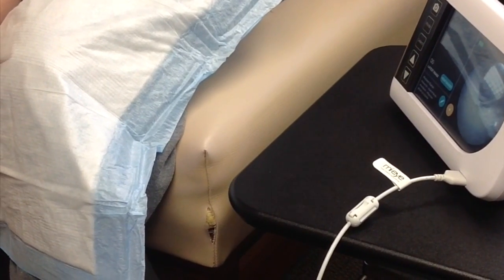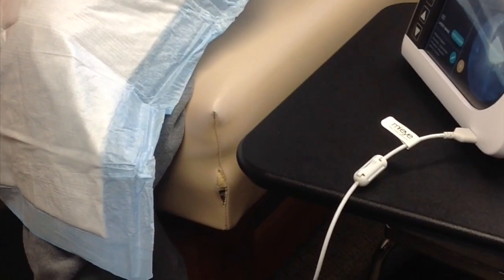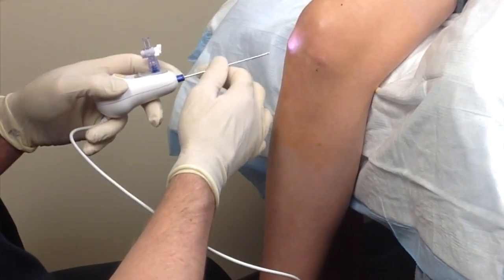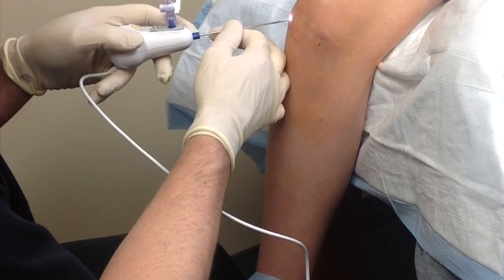Hi, I'm Dr. Chris Doherty. I'm a fellowship-trained sports medicine and orthopedic surgeon at the Agility Center in Bentonville, Arkansas. In this video, we're showing the Trice Medical MyEye device. This is a needle arthroscopy, which allows me to inspect the interior of a patient's joints in the office.